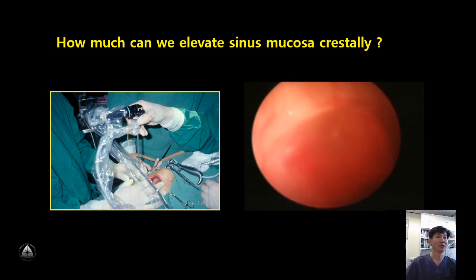This is mucosa elevation at the second molar area.